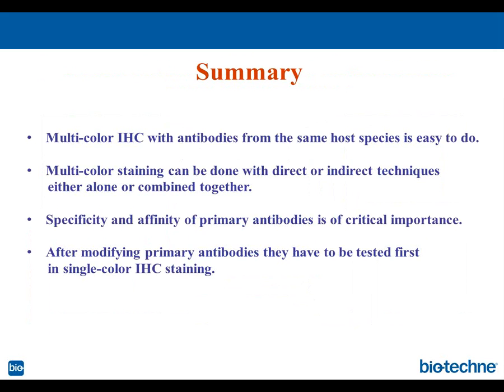Well, when it comes down to experimental biology, nothing is impossible, and we have never done this. I would say we don't do it regularly. We've done it a couple of times, but yes, it's possible to combine different retrieval techniques, because with retrieval the temperature conditions are pretty much the same. We're changing the solutions, which have different pH. We can go with a low pH, pH 6, or high pH, pH 9 or 10, and why not? It's quite interesting to try.